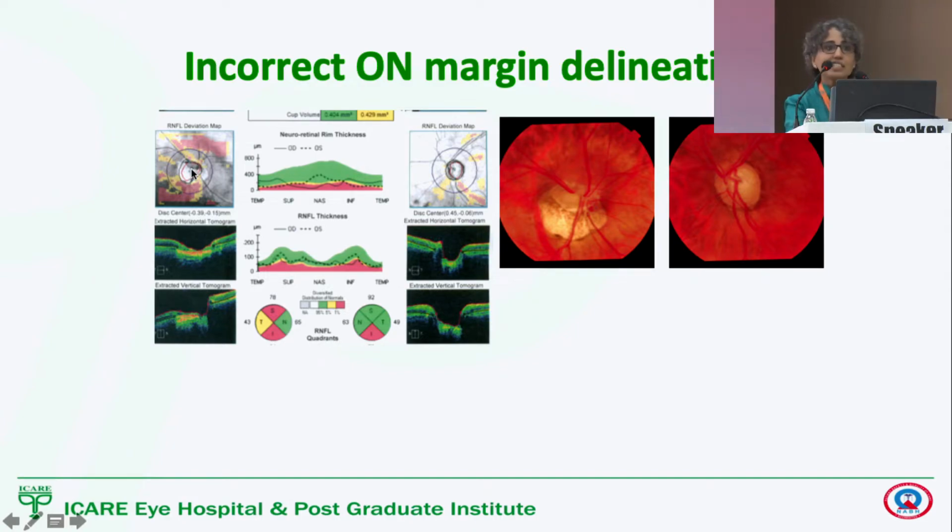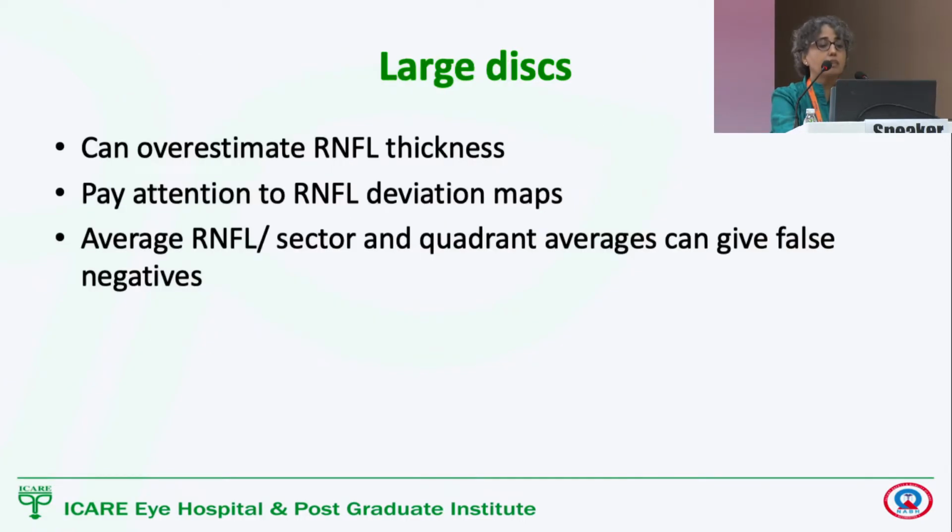So when you see the scan, the right eye values are going to be absolutely not correct for you to evaluate. You see this yellow red patch over here in the scan? This is all the scleral peripapillary atrophy being visible. So again, the machine is a machine. It cannot really understand a very significant peripapillary atrophy. So you have to just negate the values of the right eye. You can only pay attention onto the left eye and actually comment maybe on this particular wedge over here that must be of some clinical relevance if you look at the fields and the other parameters.